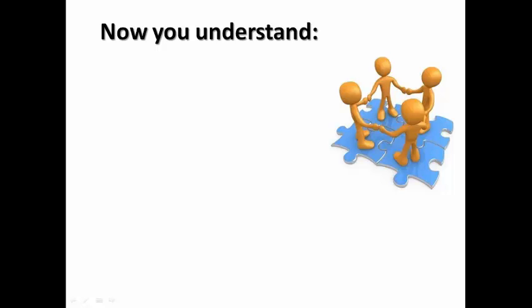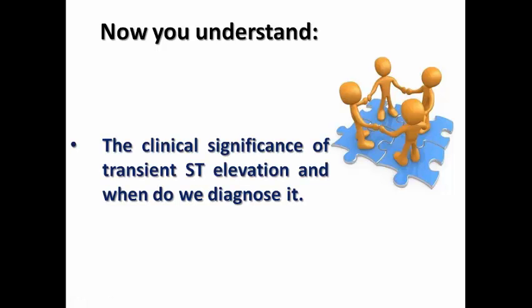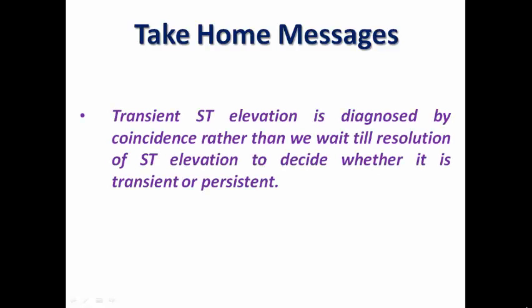So at the end of this short lecture, we learned today the clinical significance of transient ST elevation and when do we diagnose it. And our take-home message: transient ST elevation is only diagnosed by coincidence, rather than us waiting till resolution of ST elevation in order to decide whether it is transient or persistent, and it indicates high-risk non-ST elevation acute coronary syndrome rather than STEMI.